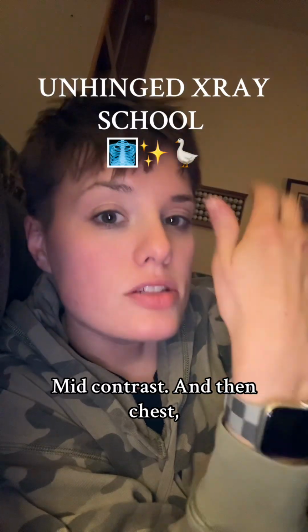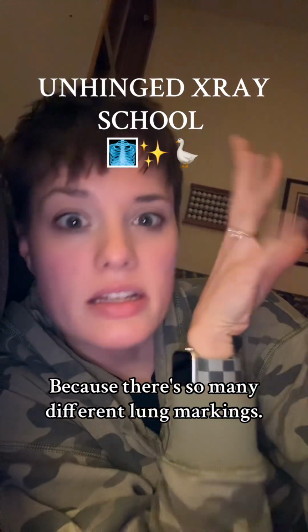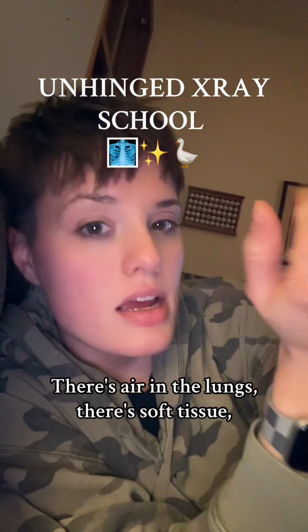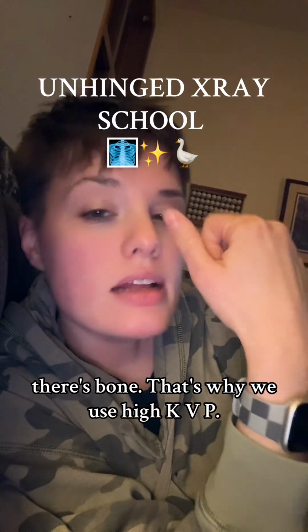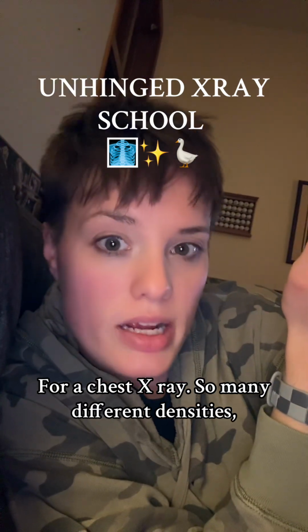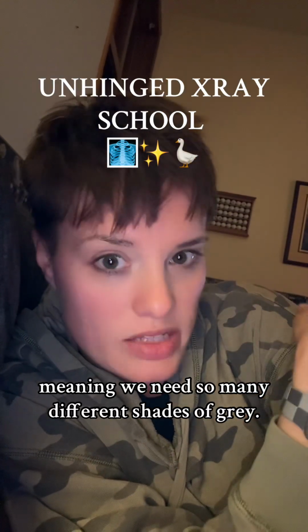And then chest, you're going to use very high KVP because there's so many different lung markings. There's air in the lungs, there's soft tissue, there's bone. That's why we use high KVP for a chest x-ray. So many different densities, meaning we need so many different shades of gray.